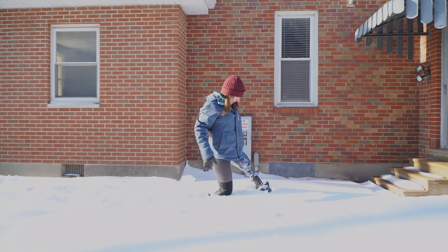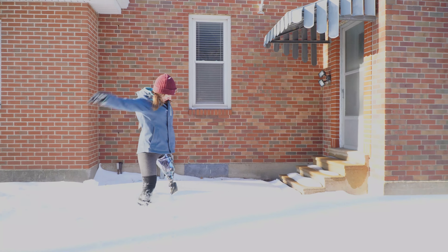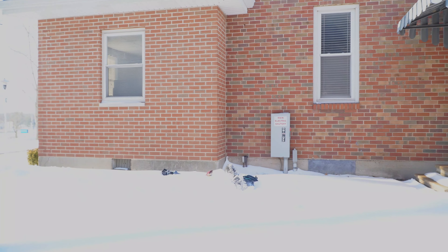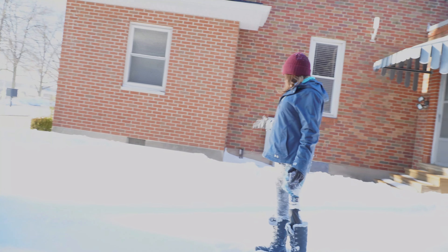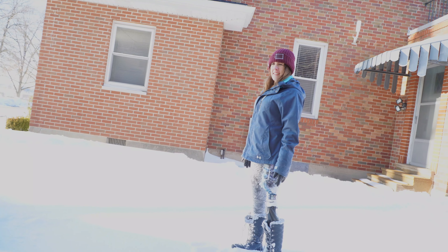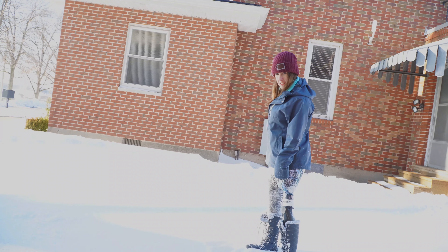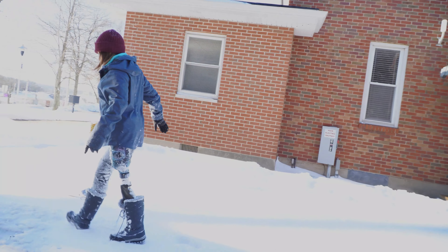Walking through the snow — if it's just smooth snow like this — is actually not that big of a deal. It's kind of awkward, but if there's any unevenness on the ground that I can't see, that translates into me being awkwardly balanced when I'm walking. Also, the snow is so thick.